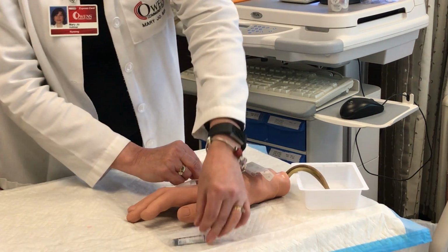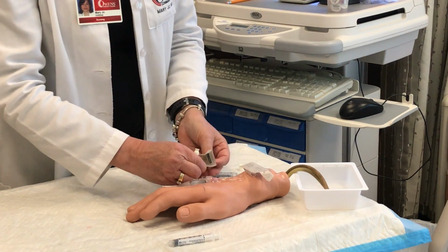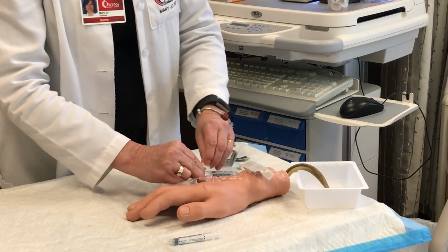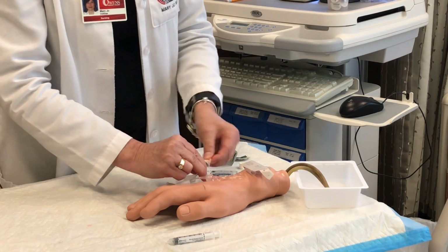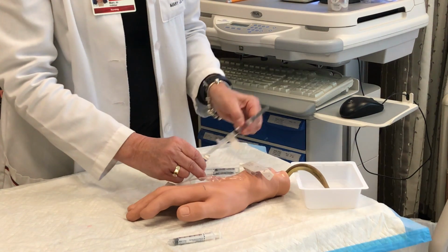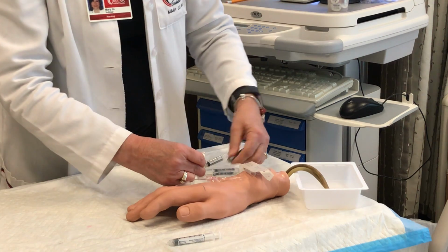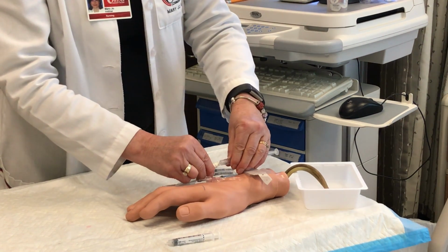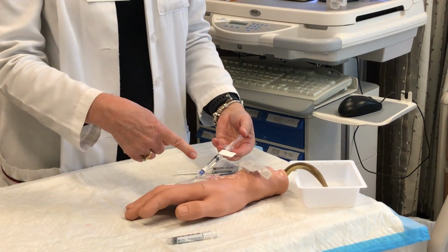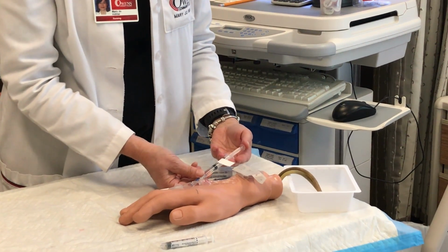And I'm also looking at the insertion site to see that there's no infiltration. Cleanse INT port per agency policy. Again, I'm cleansing the side and the top for 15 to 30 seconds. Attach medication syringe into INT port. Inject the medication in the time calculated. Observe site for infiltration. Remove syringe. At this point, I've already assessed the site, so I know I have a good IV site, so I can begin pushing my medication slowly.